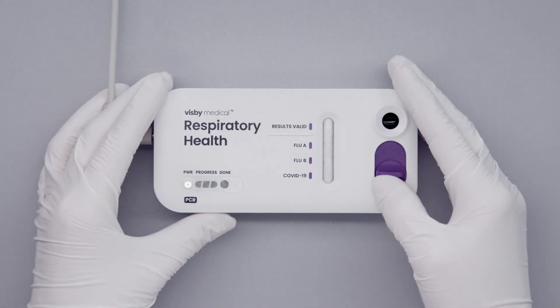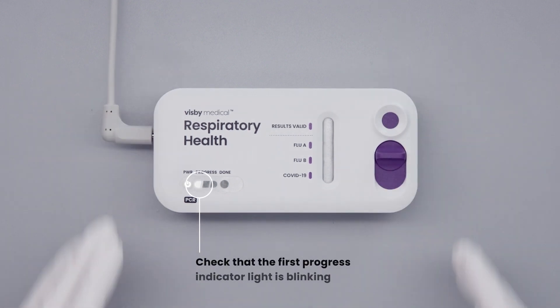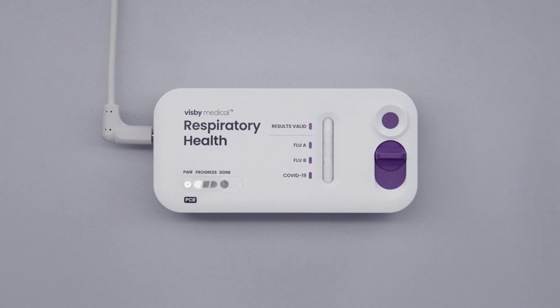Slide the switch closed to start the test. Check that the first progress indicator light is blinking. Progress indicator lights will initially blink and then become stable as the test progresses. Do not move the device while the test is running.